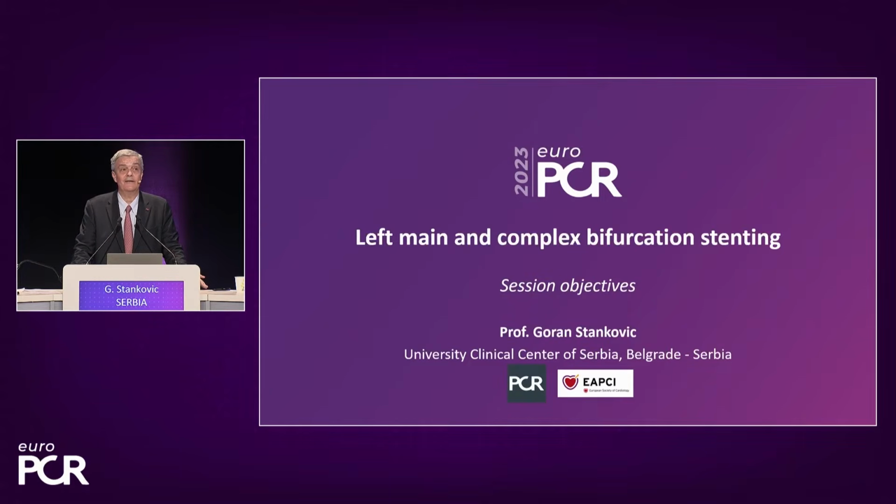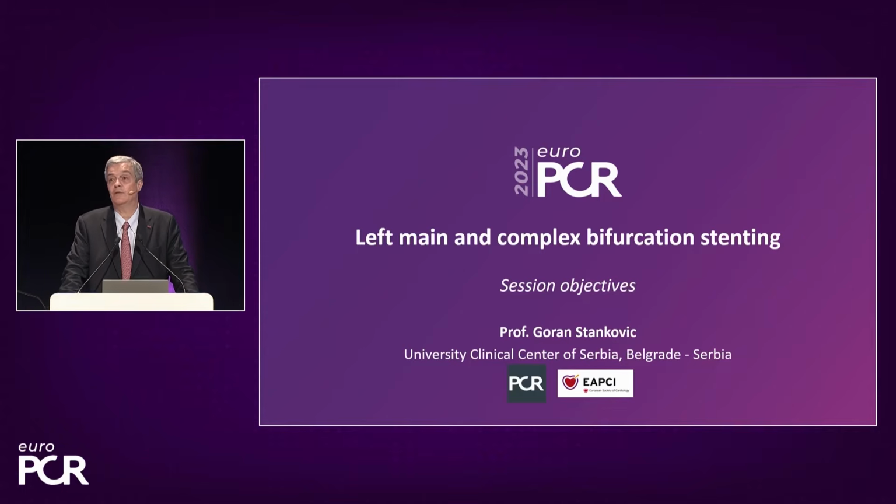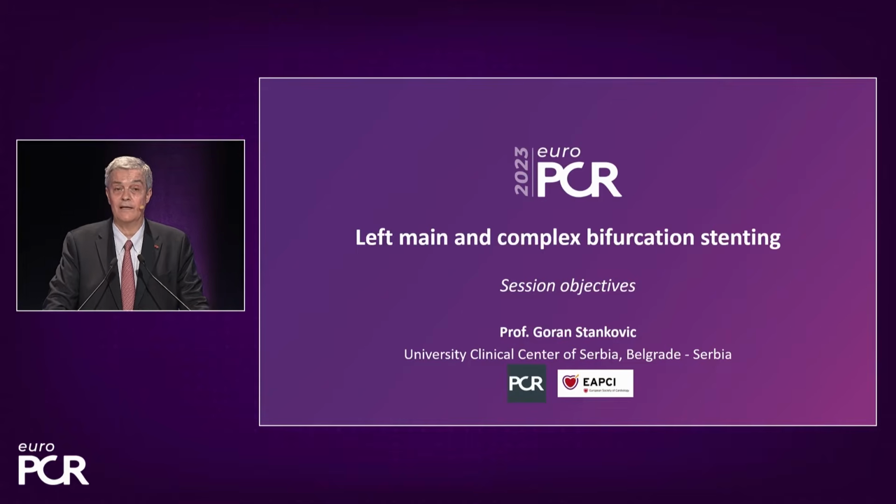Bifurcation stenting in general is still one of the most complex interventions. The number of people here in the audience really justifies the need for more education, and our goal today will be to discuss left main plus complex bifurcation PCI of the LAD diagonal.